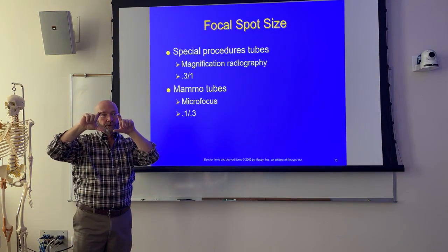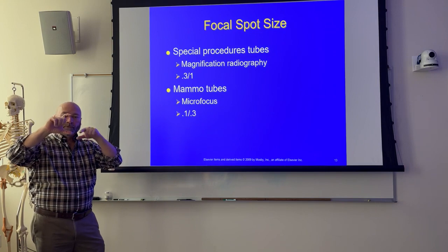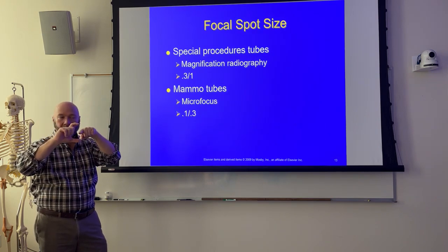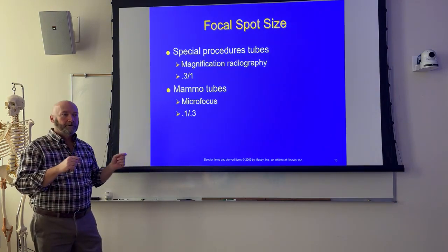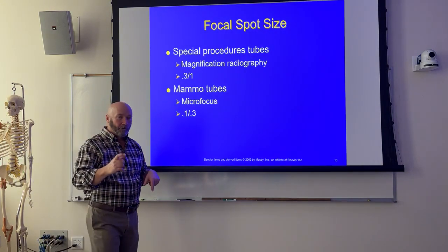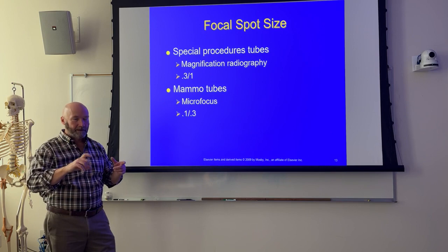And most of the time they'll use two. So they've got one C-arm coming in one direction and one C-arm coming in the opposite direction. And what they do is they put the patient dead square in the middle of that C-arm. It's always been that way, but before, the benefit to putting them right in the middle was that increase in OID without an increase in SID, and you got the magnification. But now, really, that benefit is a little bit marginalized because we can digitally magnify.